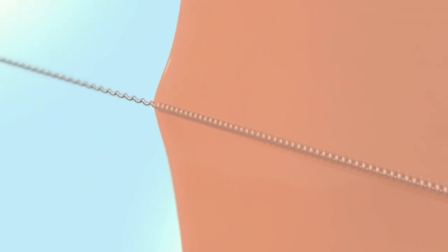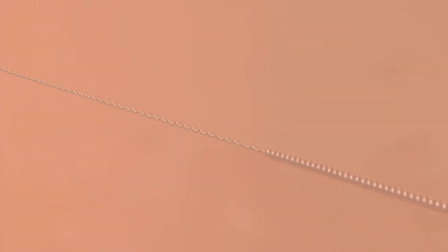When the therapy period is complete, the coil structure unwinds to facilitate its withdrawal and the lead is explanted.